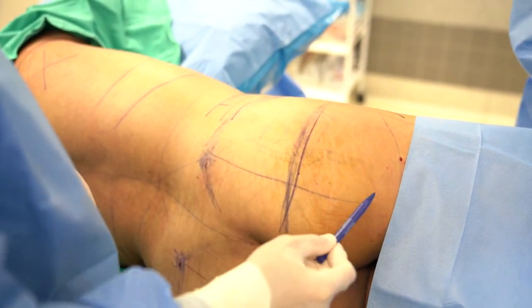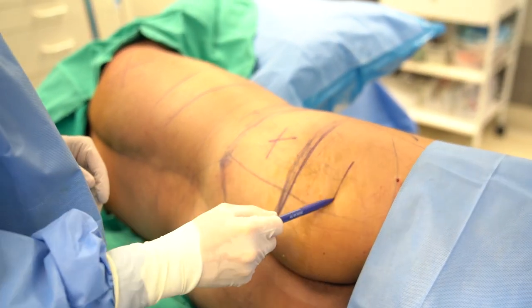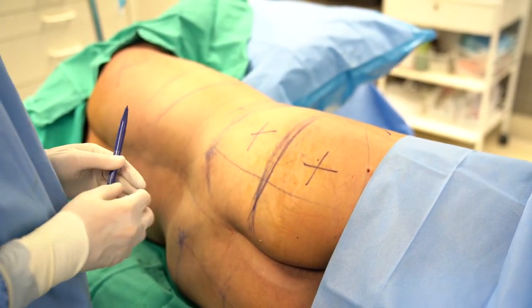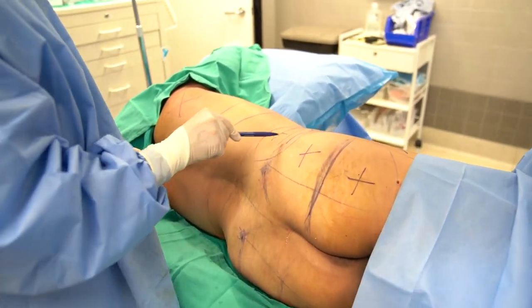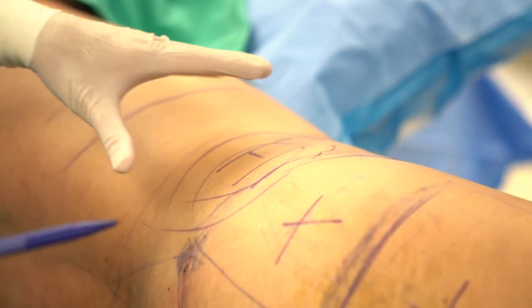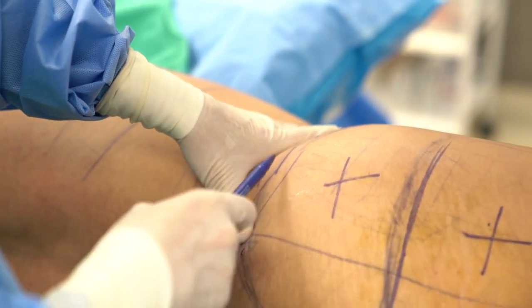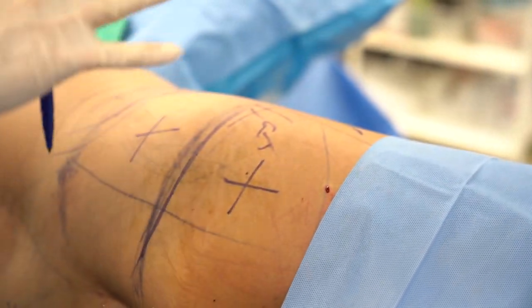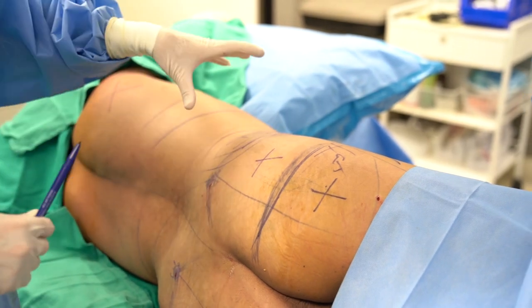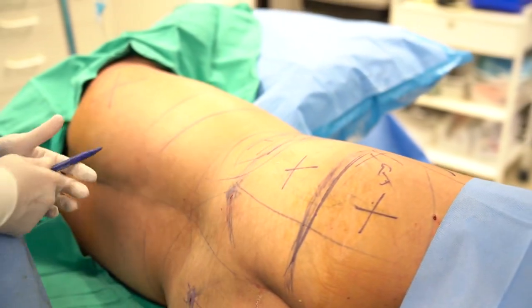I'm going to add equal amounts of fat above and below the mid buttock area to equally volumize both the upper and lower half of the butt and give her nice projection. This is where the magic happens — when all this fat is cleared out it sinks in and creates a beautiful waistline. Combined with fat grafting over here, that's what gives the dramatic waist-to-hip ratio. It's really addition and subtraction — adding fat here, taking fat out from here.